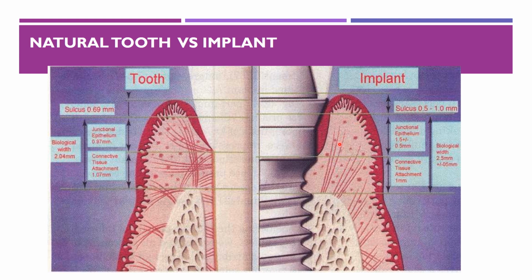Whereas in the implant, you can see that there is no tooth surface, cementum is not there, periodontal ligament fibers are not there. So the bone is directly attached to the implant surface without incorporation of soft tissue. That is what osseointegration is. Also you can see that the fibers are parallel to the implant surface, whereas here they are somewhat perpendicular to the surface. Here it is more like parallel, which enables the penetration of the probe very easily.